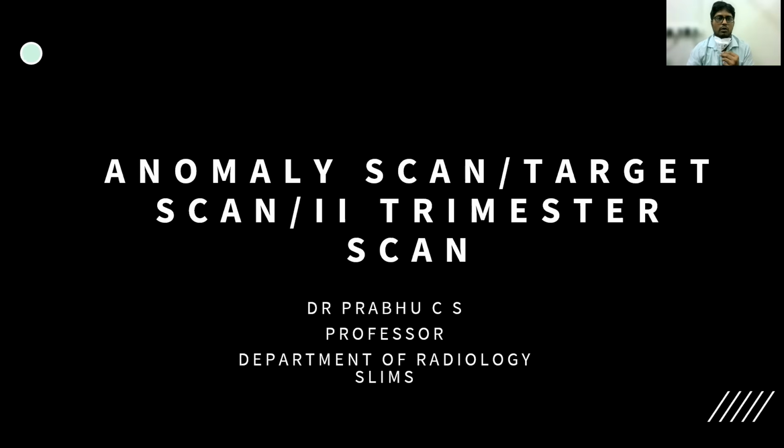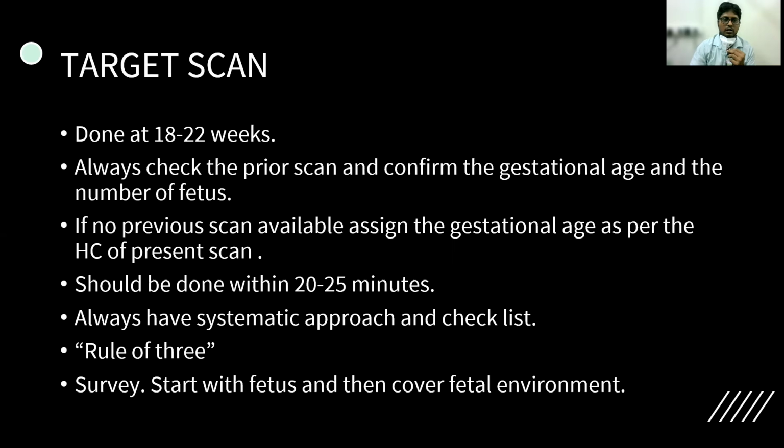Today, I'm going to talk about a very important part of obstetric ultrasound. There are multiple names to this scan. We can either call it an anomaly scan, target scan, or just plainly a second trimester scan. What is a target scan?